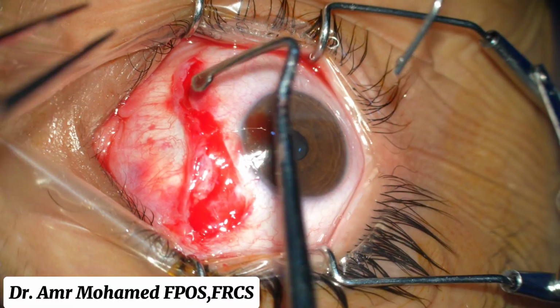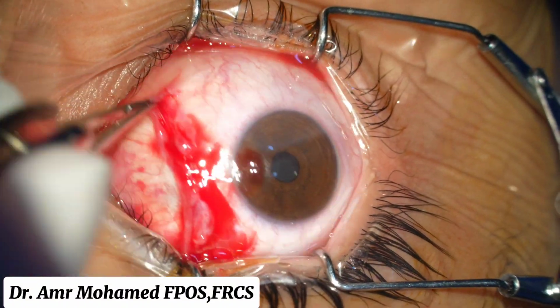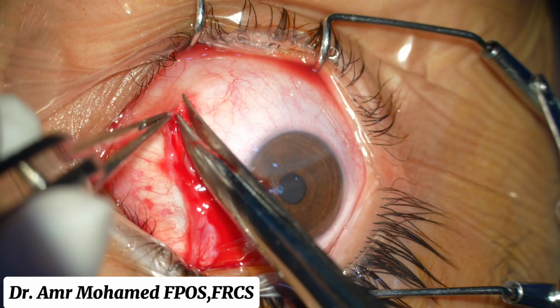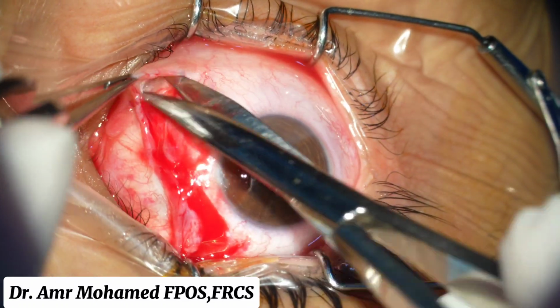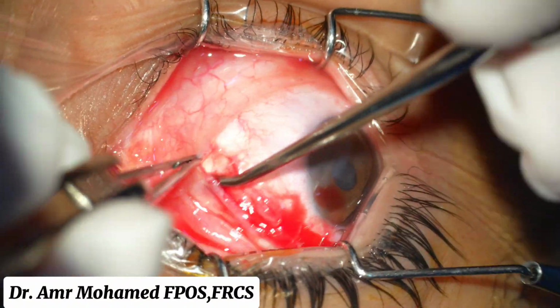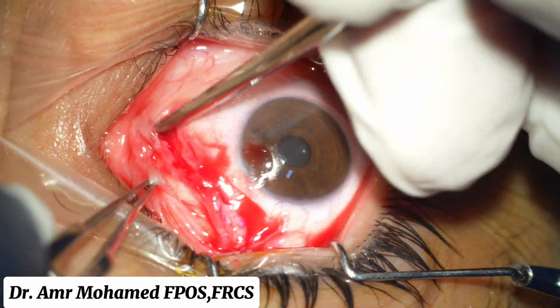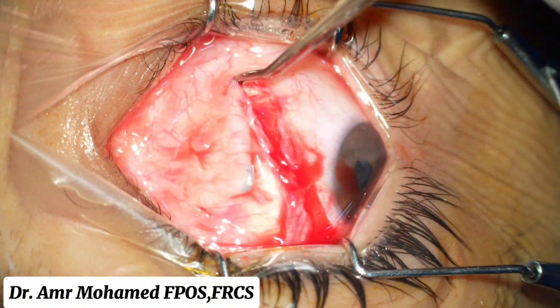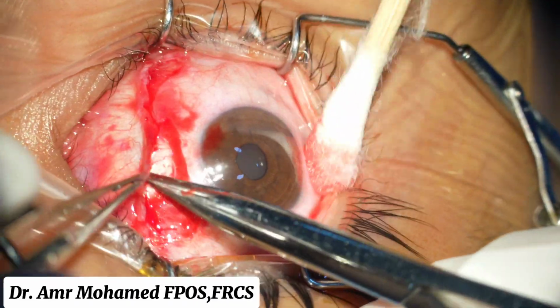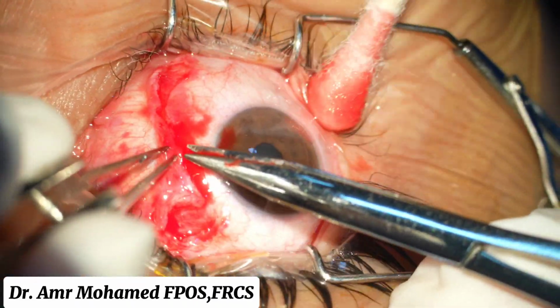As you can see, there are a lot of adhesions between the conjunctiva and the episclera and sclera, and that can happen because of many causes. One of them, poor surgical technique, and sometimes the nature of the patient and how the tissue reacts with the surgery.